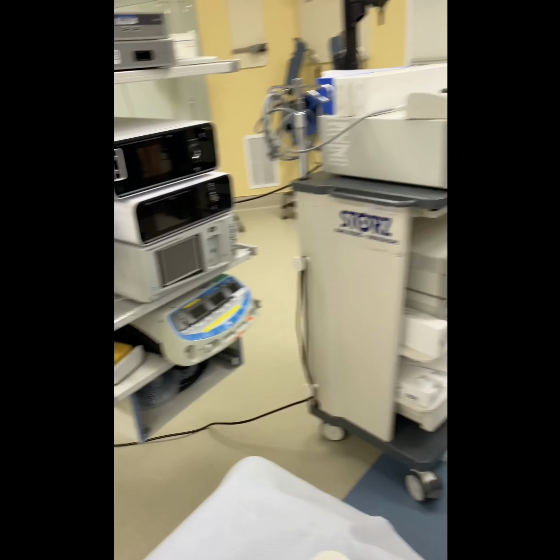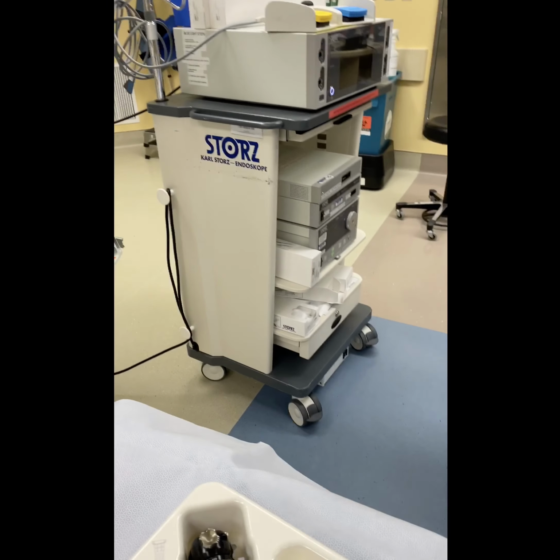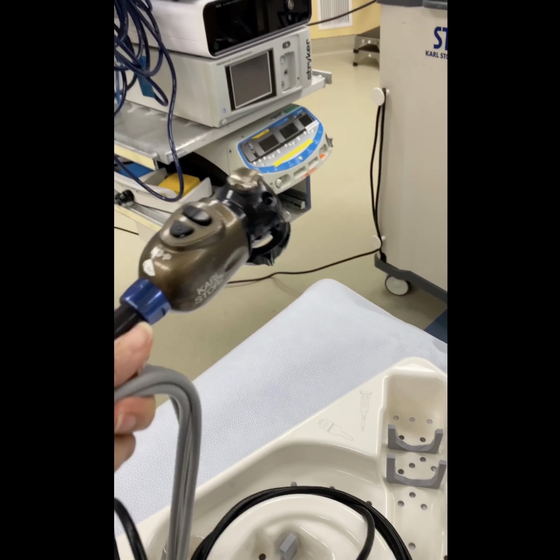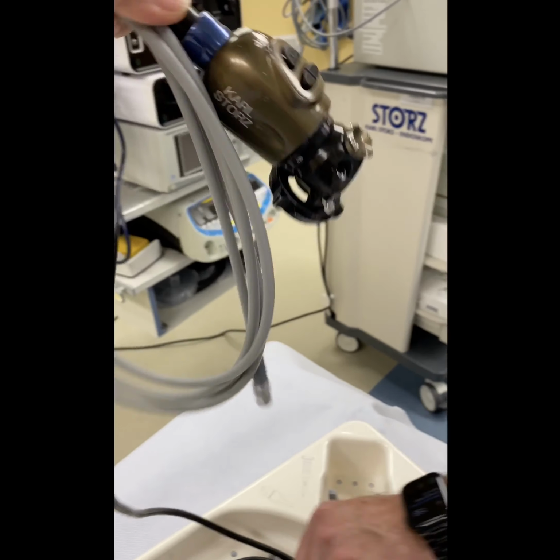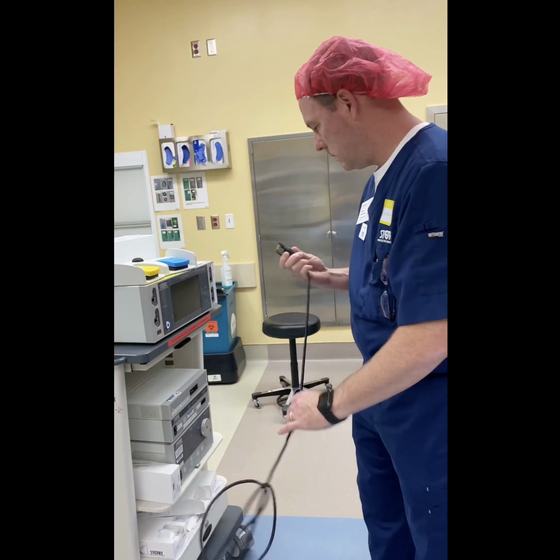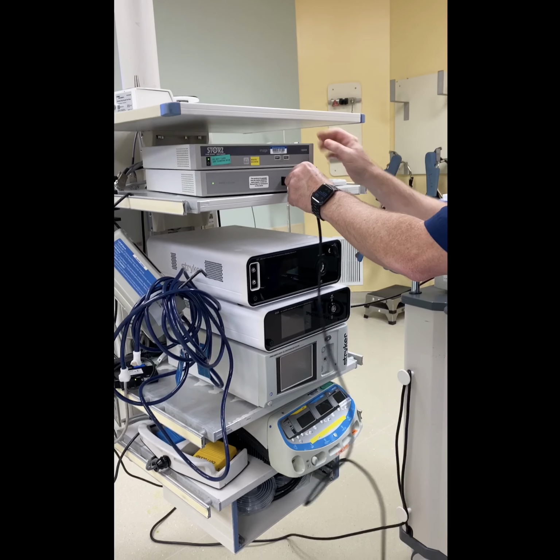So now that you have your patient in the room, obviously there's no patient here right now, we're going to plug in our regular downward camera. So I'm going to plug that in and we'll show you how it looks. I have Rob here assisting. Yep, up here. So this is your regular downward camera.